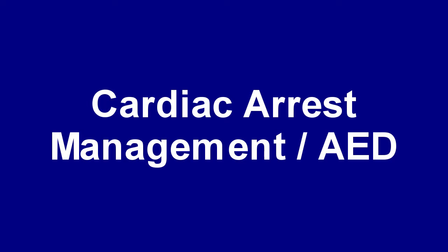This skill is designed to evaluate your ability to manage an out-of-hospital cardiac arrest by integrating patient assessment and management skills, CPR skills, and usage of an AED. You arrive on scene by yourself and there are no bystanders present. You must begin resuscitation of the patient in accordance with current American Heart Association guidelines for CPR. You must physically perform one rescuer CPR and operate the AED, including delivery of any shock.